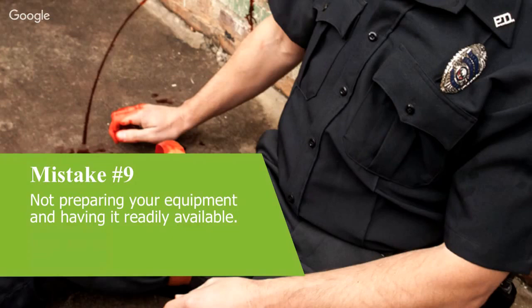So Noel's saying that New Zealand policy is to pre-fold them ready for use. And that's great. I mean, certainly for the CATs, which is a very widely issued tourniquet around coalition defence, you want to have that pre-folded so none of the Velcro is touching each other. If you have it folded with the Velcro touching, then obviously it's going to stick to itself. So you will not be able to open it up. You won't just be able to drop it one-handed and it opens up in a loop. So having that operationally set up, same with the SOFT-T, having the tourniquet pre-folded, and possibly even removing those elastic bands so you can easily deploy them.